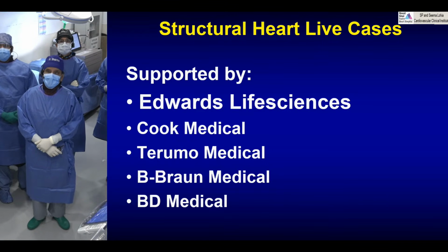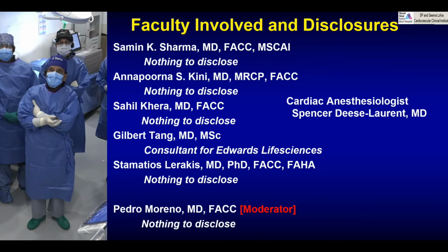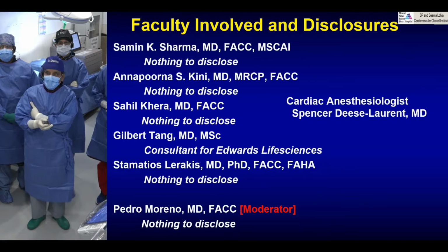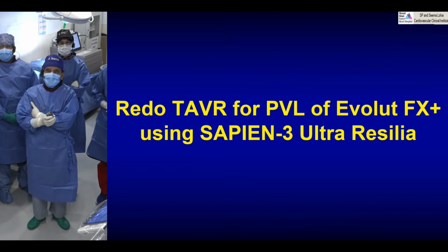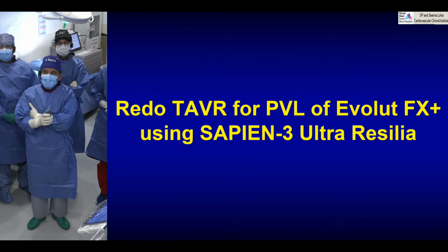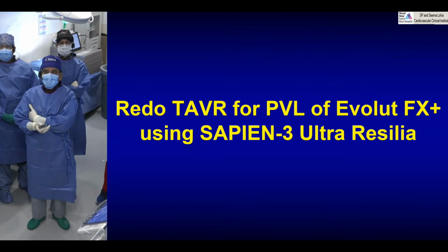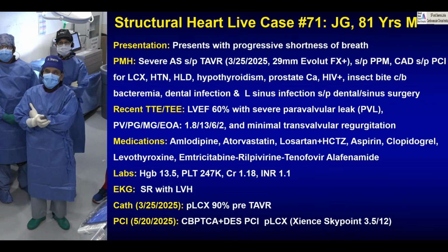This is supported by our usual faculty, starting with the cardiac anesthesiologist Spencer Laurent. The case is very interesting. It's a redo TAVR for PVL of an Evolut FX Plus using a SAPIEN-3 Ultra Resilia. What is new about it? We have shown so many cases. Well, we have not shown this case because it was done in March of this year.